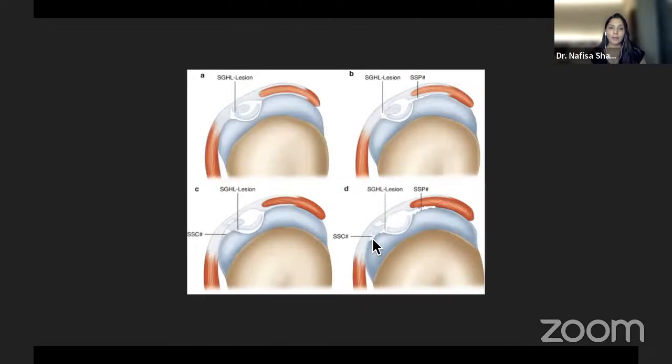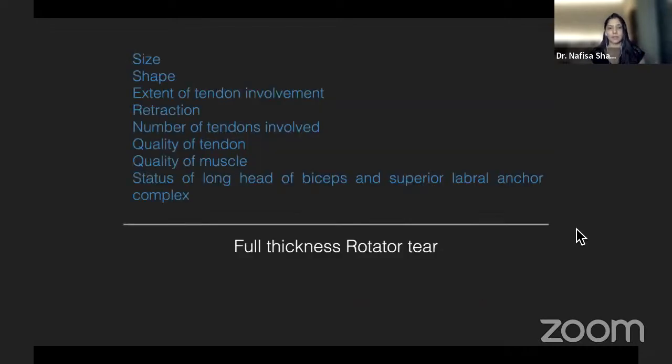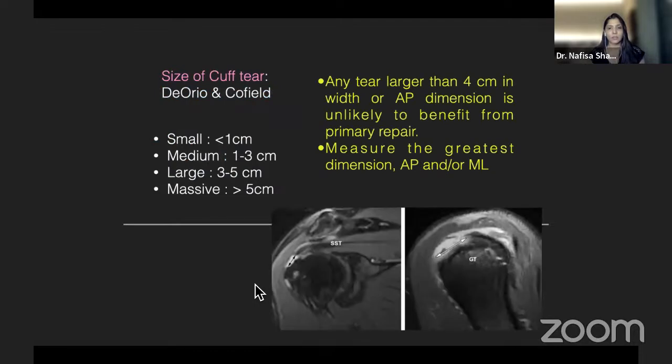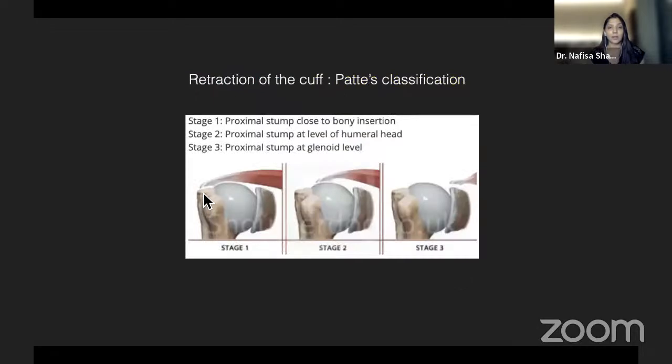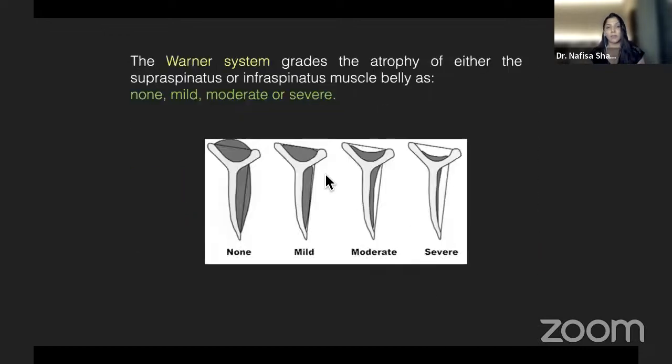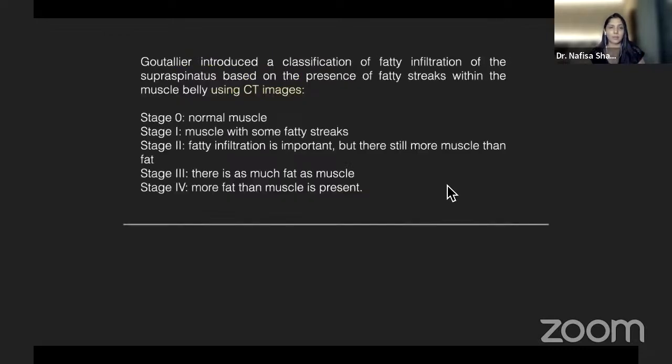Whenever you have a partial thickness tear of the anterior supraspinatus or the superior subscapularis, it can also be with a concomitant pulley lesion. When it comes to full thickness tears, however, there's far more information required. One wants to know the size of the tear, which is mediolateral as well as anteroposterior dimension of the tear on the MR. One also needs to know the amount of retraction of the tendon and the muscle belly of the cuff, which means that you want to know how much is the volume reduction. So the occupation ratio can be used for the supra as well as infraspinatus, or we can go by the amount of fatty streaks within the muscle belly. So the Goutallier classification is used, and sometimes both are present.